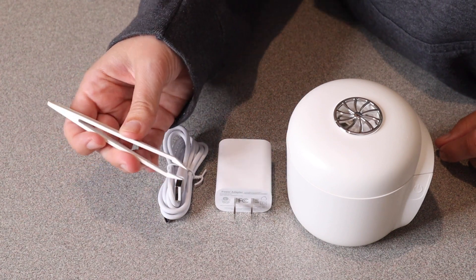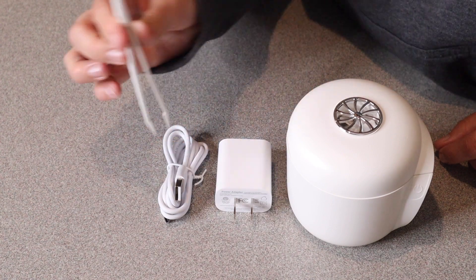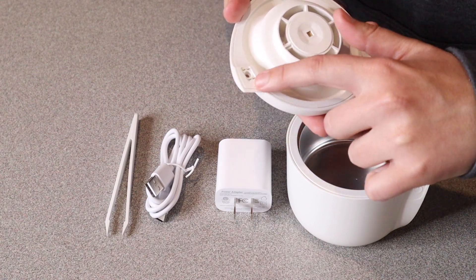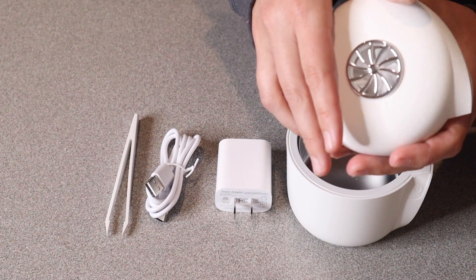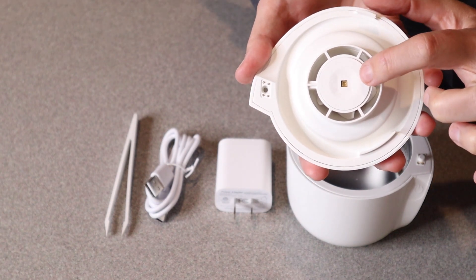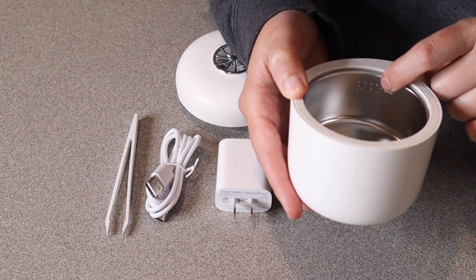This also comes with some tweezers to be able to remove and insert different items inside the water once you have it filled up. If we take the lid off right here, there is a little magnet that keeps it attached. You can see the magnet is right here and then the fan is right inside this area. You can kind of see the fan from the outside. Right here, this little light in the center — that's the UVC sterilization lamp.